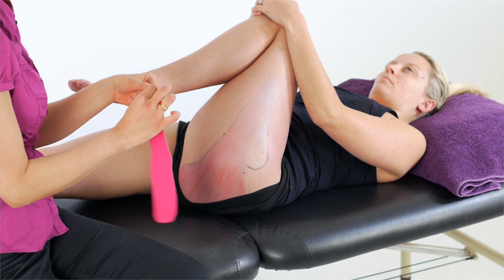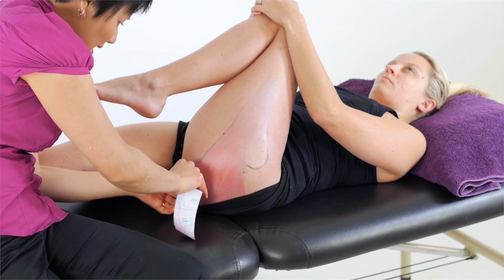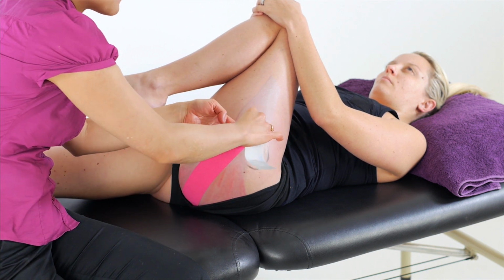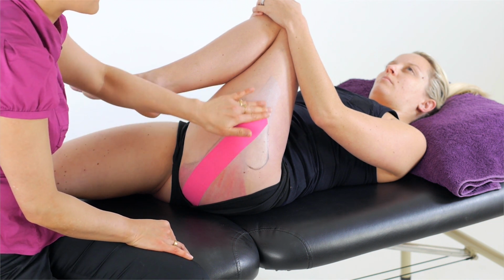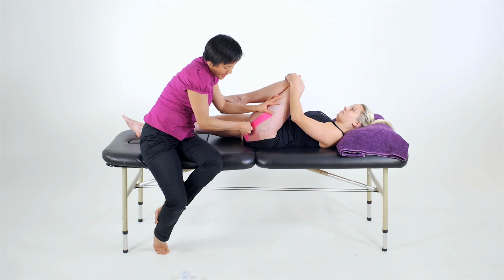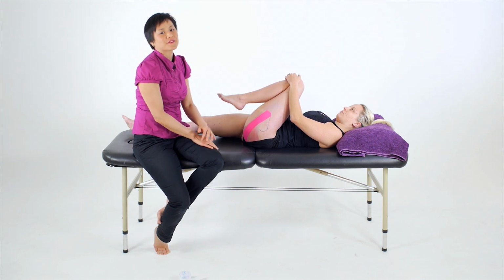And we'll roll the tape off the backing and let the initial anchor settle to zero tension before placing it on our origin. And from here we roll the tape off the backing and stretch it out to 25 to 35% of the available tension before letting the final anchor settle to zero and then placing it on our insertion down on the femur and the iliotibial band. Rub the tape to activate the glue, and once we've completed our taping application, we'll make sure to reassess the muscle for changes in strength as well as any other functional gains.